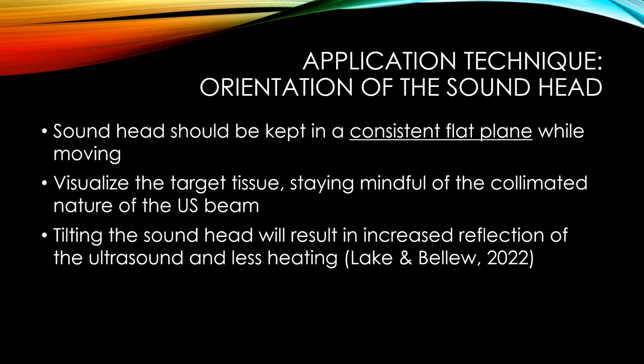Avoid tilting or rocking the sound head. First, tilting makes it harder to keep the target tissue within the ultrasound beam. Second, tilting causes increased reflection at tissue interfaces. Tilting as little as 15 degrees off parallel will result in significant reflection, and you won't achieve the heating effects you're hoping for.